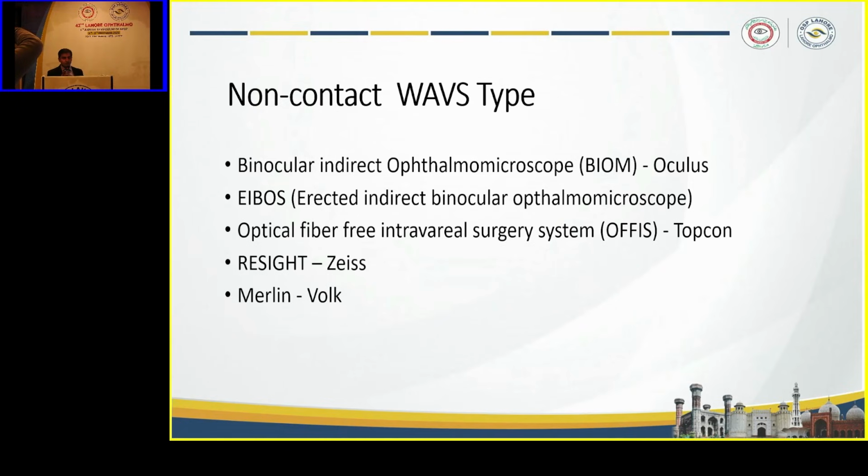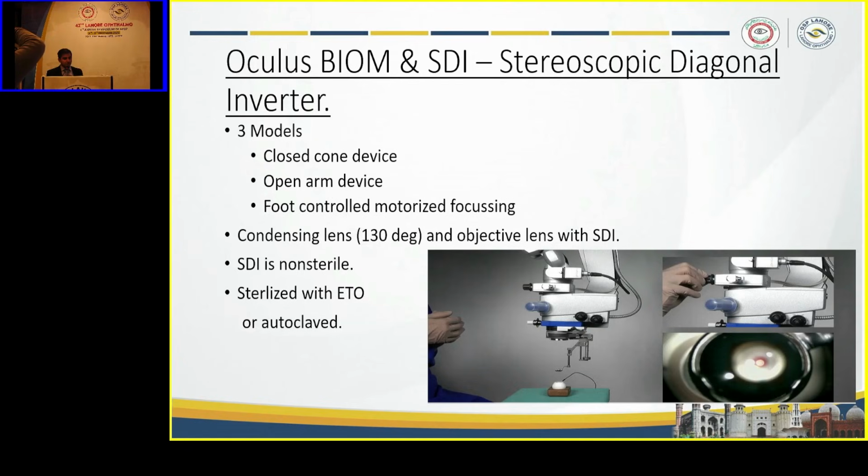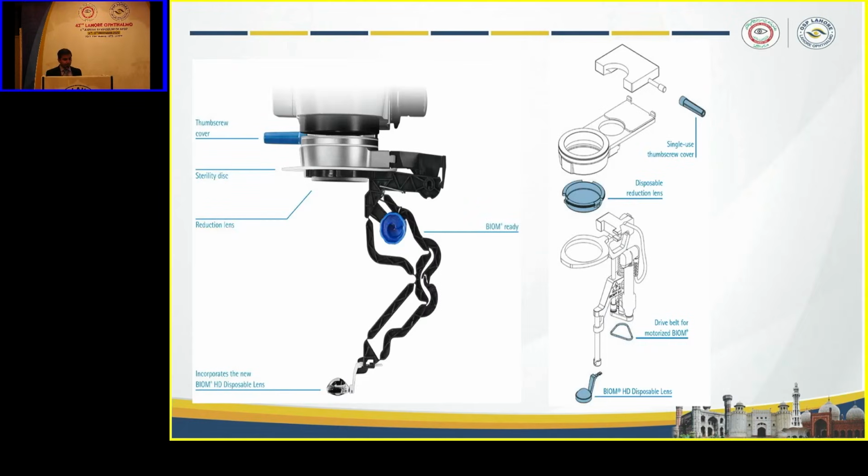Currently, we are working with the non-contact wide-angle viewing system. The BIOM by Oculus, which works with stereoscopic diagonal inverter. It comes with three models: closed cone, open arm, and foot control motorized focusing system. It has a condensing lens of 130 degree and objective lens with SDI.